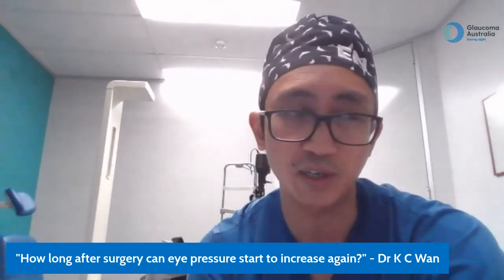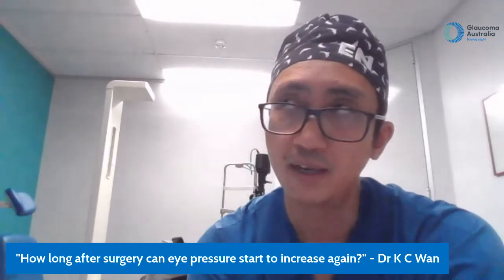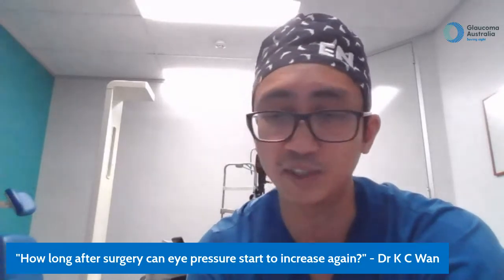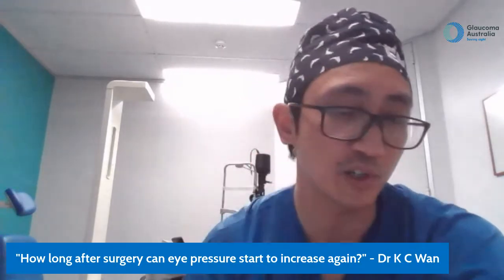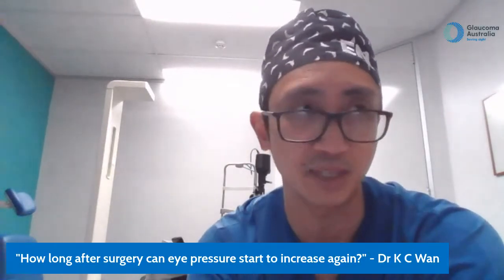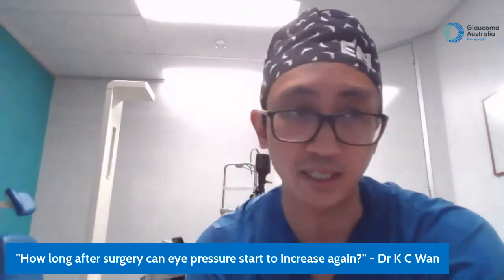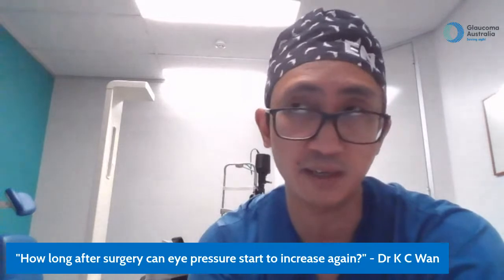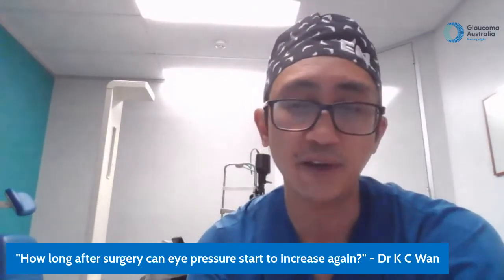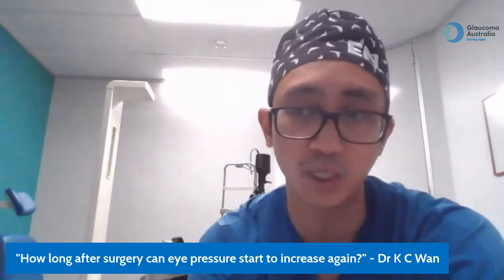So trying to get the pressure on point is difficult, which is why, for example, the Ahmed valve designed by Ike Ahmed has a valve inside of it to get you that perfect pressure, if you will. But like all things you put in the human body, if it has a valve, it sometimes then clogs up years down the track. So the answer is it can fail very quickly, or it can fail 3 months down the track, 6 months down the track, 10 years down the track. And the failures at different points can happen for different reasons, and the way you manage them is different as well.